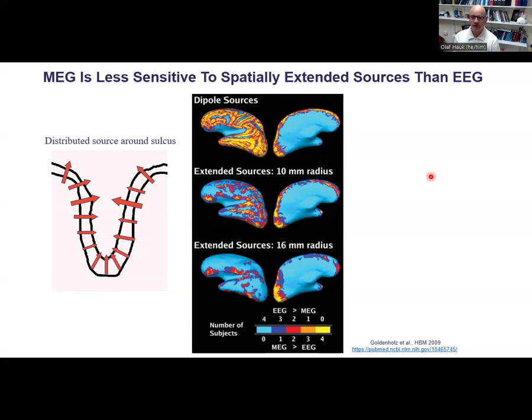Look at the literature and see if people have reported a preference for MEG or EEG. But if you can, my suggestion always is to record both EEG and MEG. Yes, you have to get your hands dirty with EEG. It takes a bit longer, but you can always ignore the data later if you think you don't need them. It's also usually a good idea to compare ERP effects with existing literature, if you then want to show your results with MEG. But at least you should be aware of these different properties of EEG and MEG.